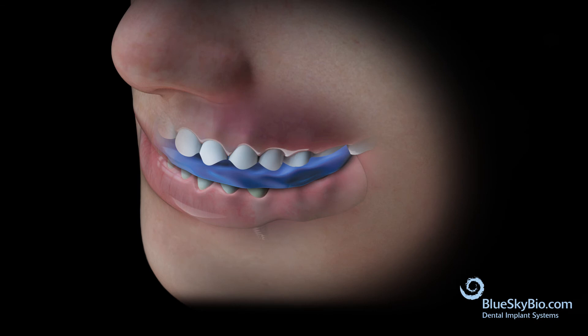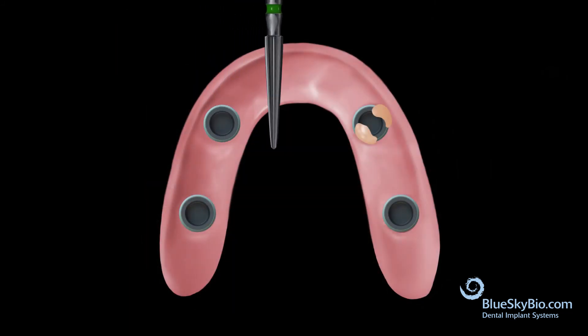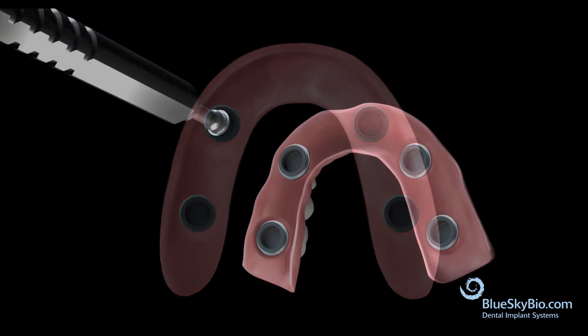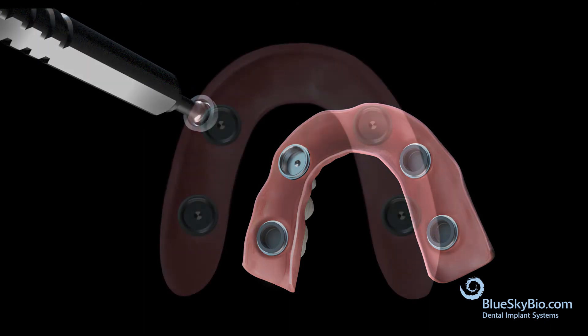Once the material has set, remove the denture from the mouth. Trim any excess resin around the housing and ridge areas, then polish the denture. Use the insertion tool to remove the processing inserts and replace with the appropriate retentive insert.